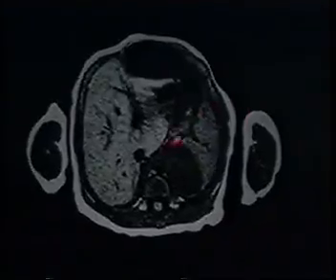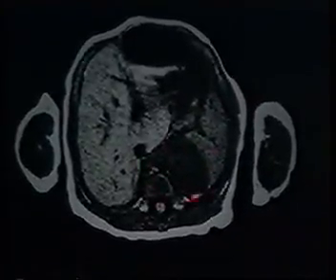Does this represent an extralobar pulmonary sequestration? We really don't identify all that clearly anomalous vessels here. I show you the corresponding CT. There is an area of low density, again, subdiaphragmatic. And I'll show you the equivalent MR in the axial plane. You can see that there is a mass here which has very little signal on a T1 weighted sequence and has considerable signal on a T2 weighted sequence. But again, we were not able to identify the presence of anomalous vessels. As I've pointed out, I don't think using spin echo images by themselves is sufficient.